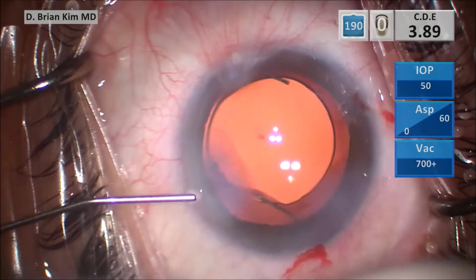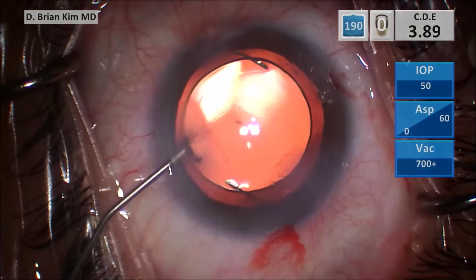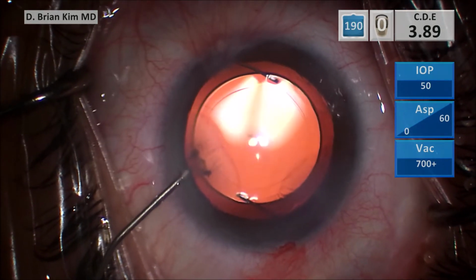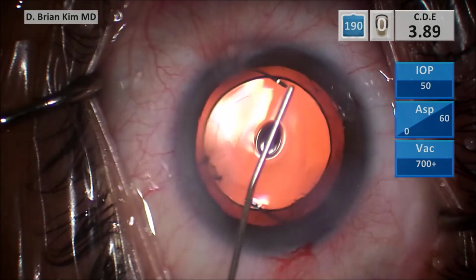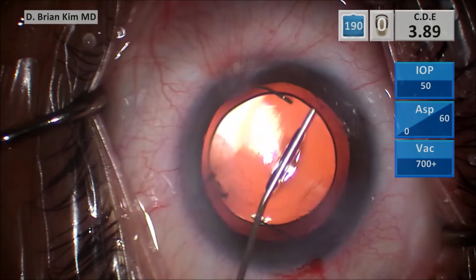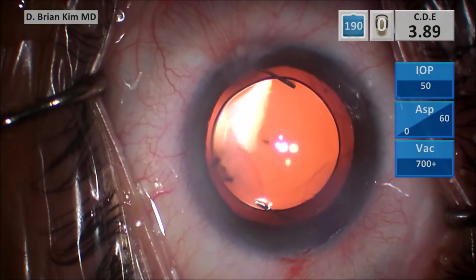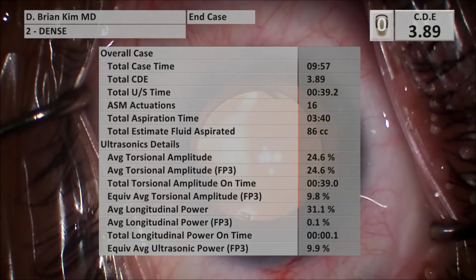This makes the technique so versatile, and you can use sparing amounts of ultrasonic energy and then grabbing lens pieces with high vacuum and then crushing the lens between the instruments into smaller and smaller pieces. Once the lens pieces are small enough, you can use sparing amounts of ultrasonic energy by maximizing mechanical fracturing forces to disassemble the lens and reducing the amount of ultrasonic energy. You can have clearer corneas post-op day 1, a better patient experience, more of a wow experience, again, reducing the risk for complications as a result. And this is why I feel this is the best way to do cataract surgery.